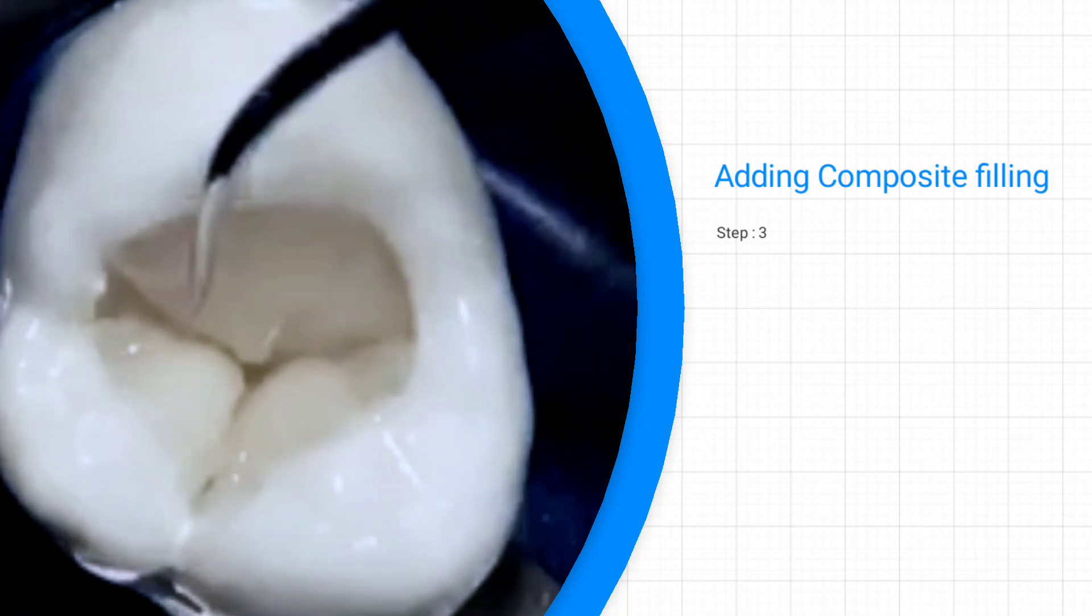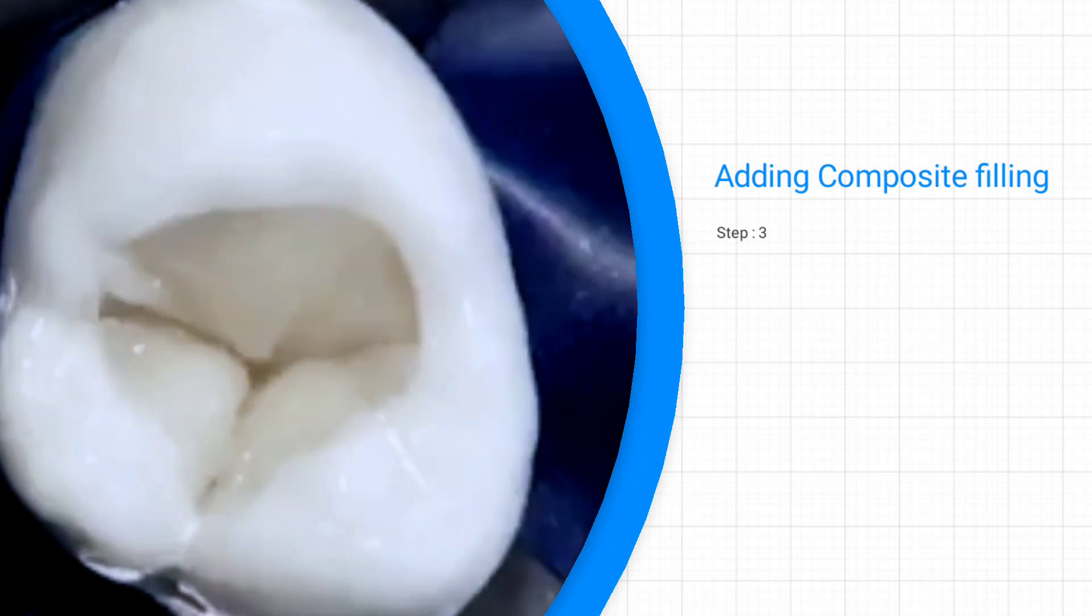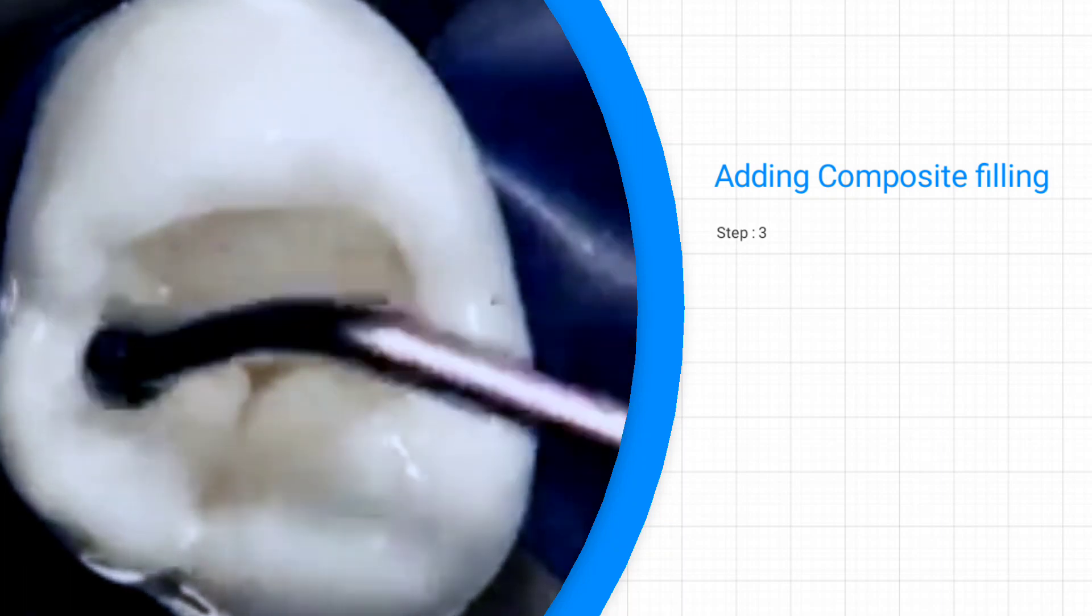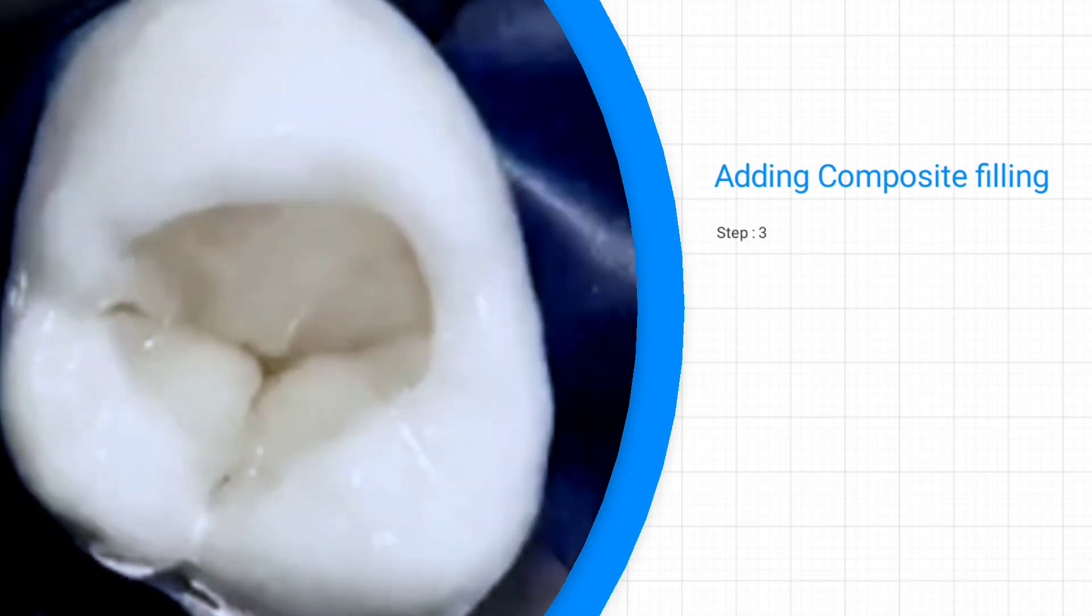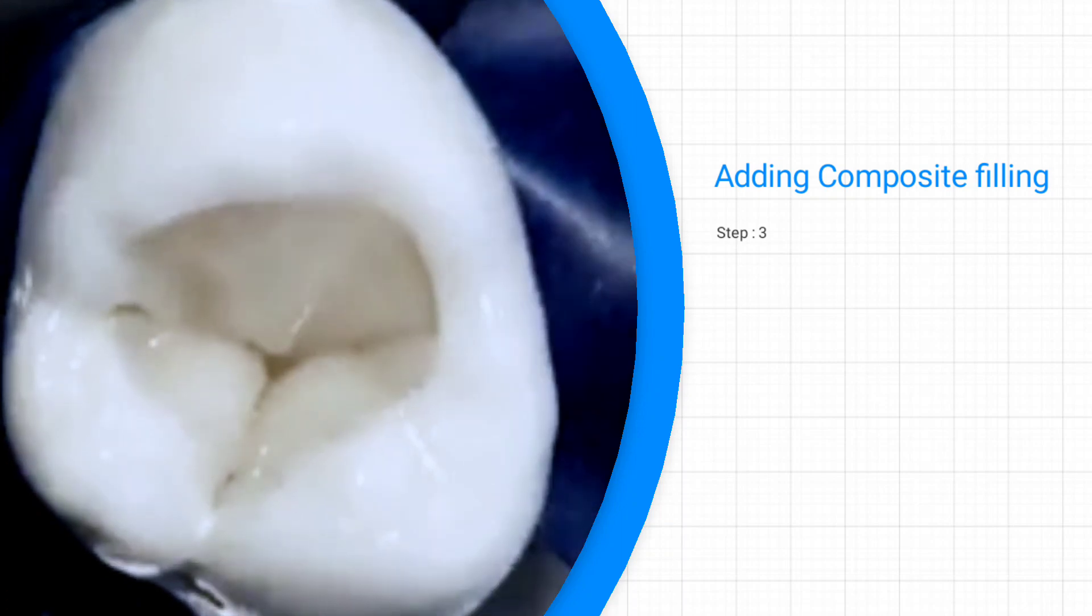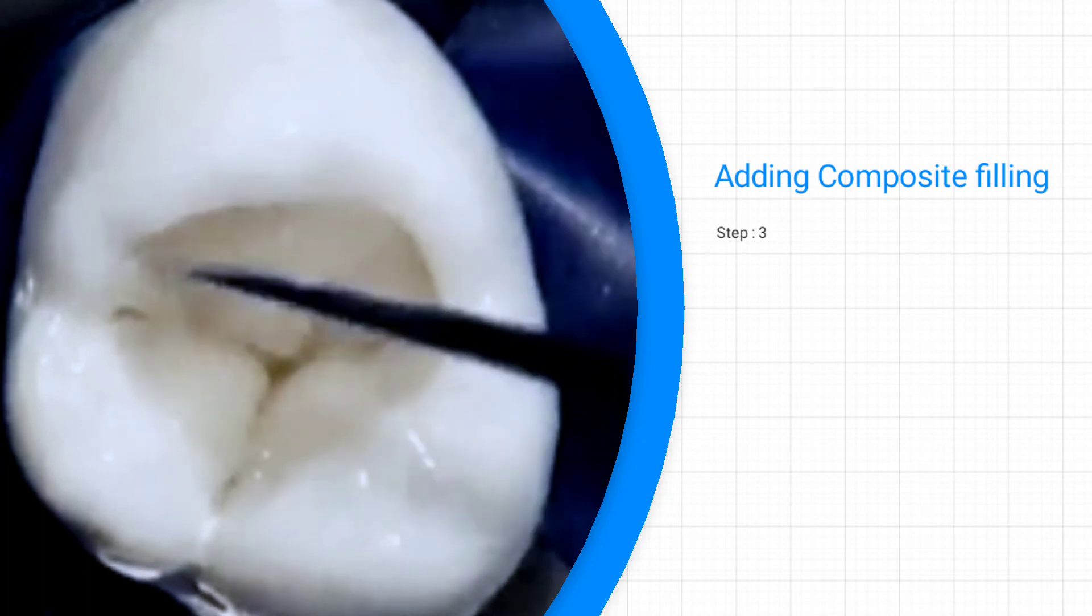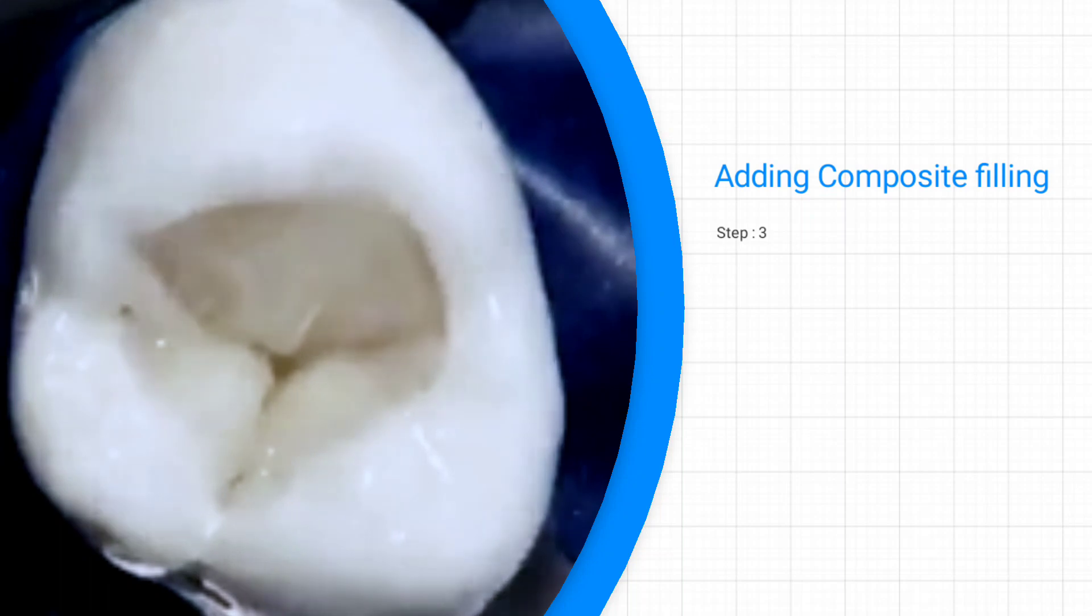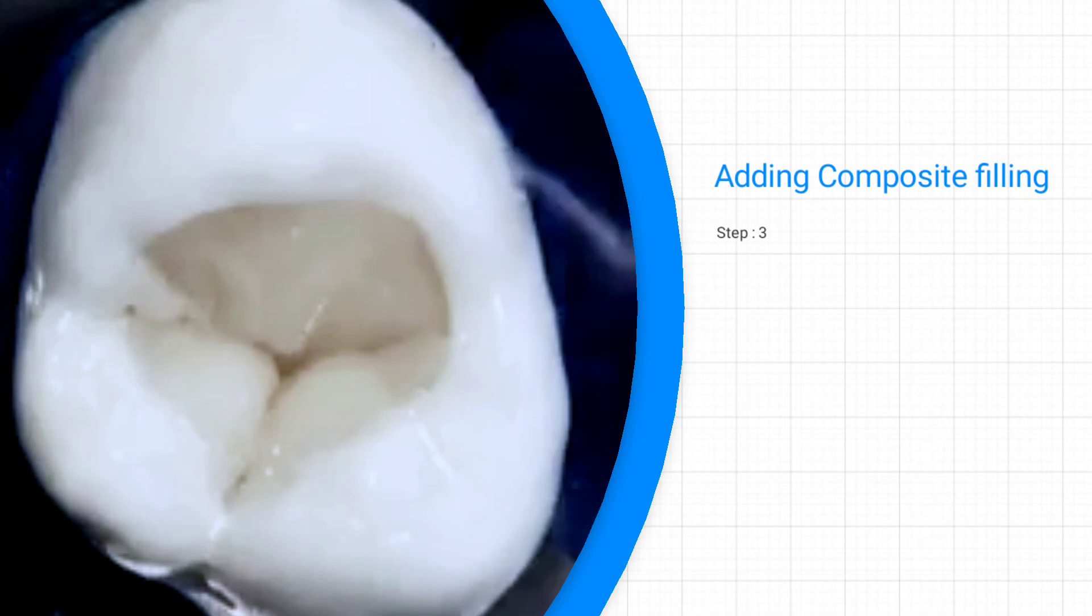With composite filling, you can regain the structural integrity of your teeth. Make sure that the preparation is clean and the bonding stages are adequate. That way, your composite filling will adhere to the tooth. This type of dental restoration can match the shade of natural teeth, and that is why this kind of restoration is more appealing to people and patients. Because of this, the tooth appearance and functions come back without anyone else knowing it.